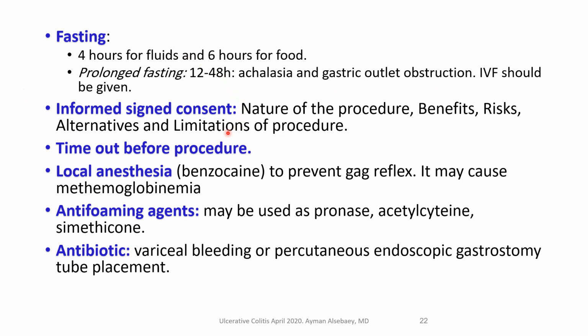Of course, before doing endoscopy, you should have informed signed consent, and you have told your patient the nature of the procedure, what the benefits are, what the risks are, what the safe alternatives are, okay, and what the limitations of the procedure are. Time out before the procedure is very important. Before touching your patient with the endoscope, you should revise the name of the patient, his file number, the indication for the endoscopy, and the requested endoscopy.